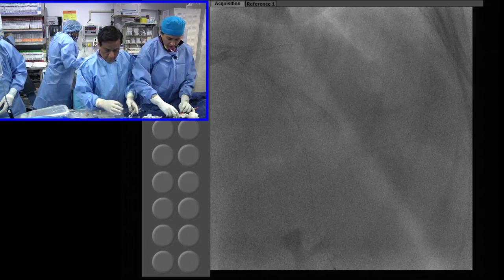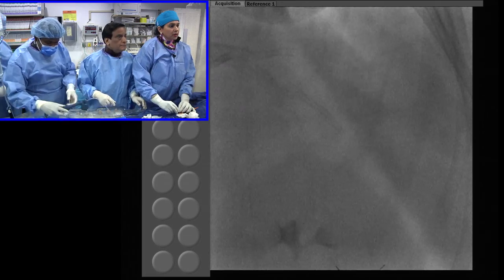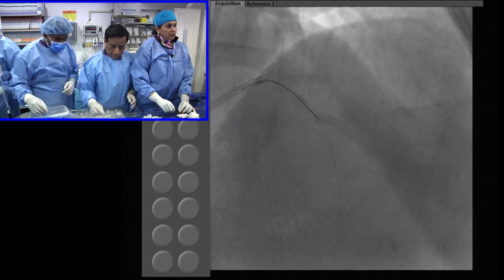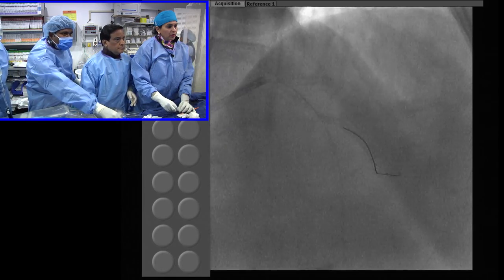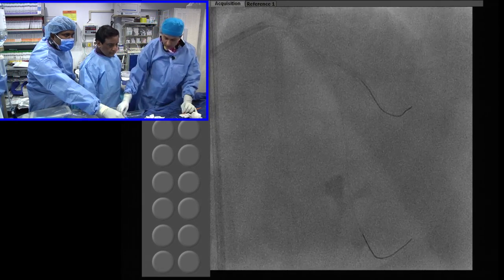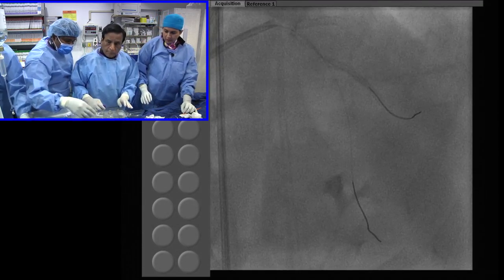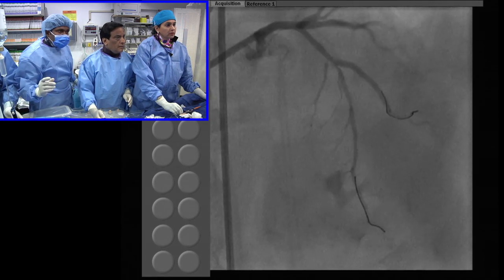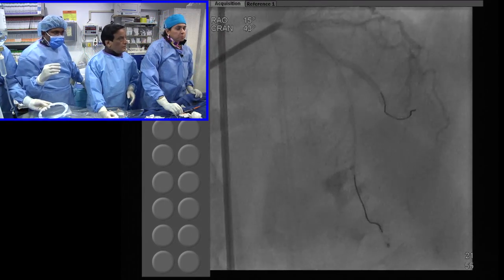Good. You want to take a picture now? Sure. Now let's recross it. Then we take a picture. Okay. Cine. Okay. Do it again. You want to do hand? Good. Well, the diagonal looks pristine. Fine. Yes. So far so good.